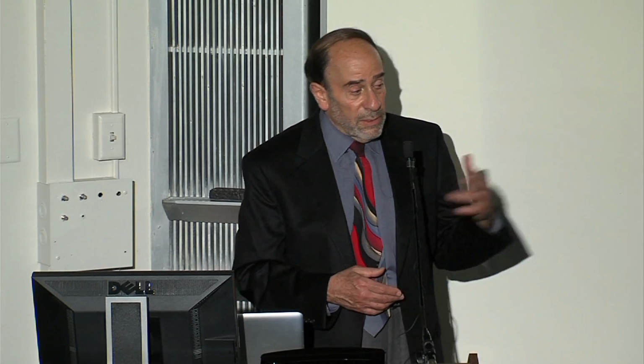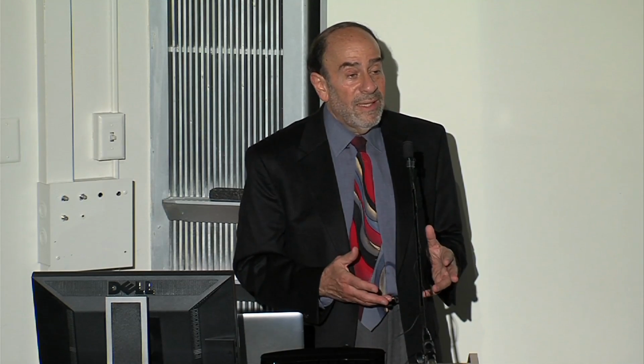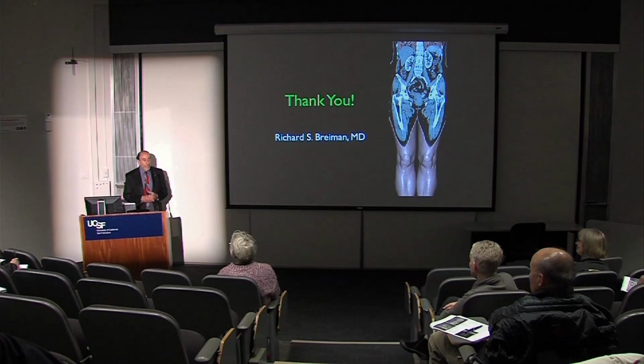And I did a lot of research on some of the early PACS, that picture archival communication system. That was also an academic interest of mine. I was a consultant to multiple companies on developing those systems that have now become absolutely essential. But in those days, you'd have to drive in for everything. And then I had access to a system that could do this sort of thing. It was sort of jerry-rigged, put together from equipment from a couple of companies I was consulting with, and I put it into the hospital.